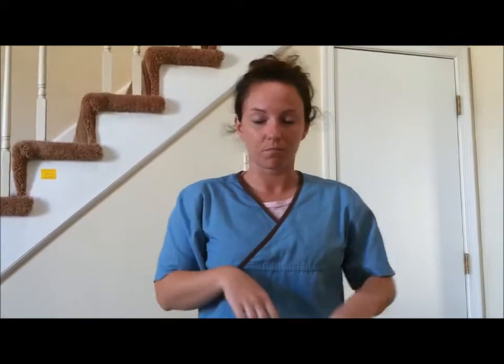There are 4 main things you can do for radiographing. One is a whole body ventrodorsal view. Another one is the whole body lateral. You have the caudocranial wing view, or you can do a GI contrast study. The whole body VD view, you place them on their back, wings open, body as straight as possible. You want the sternum to be on top of the spine.